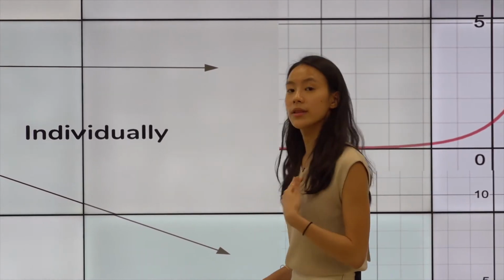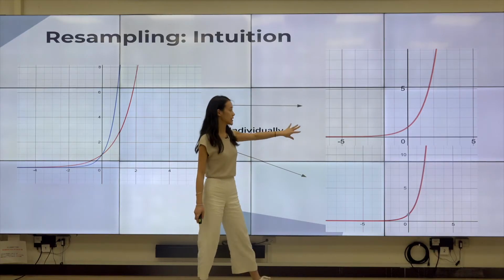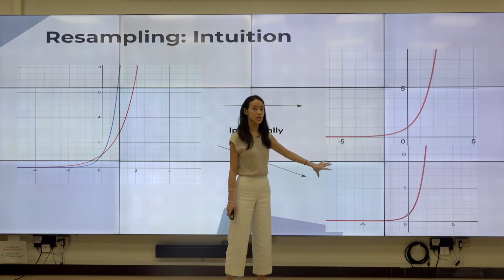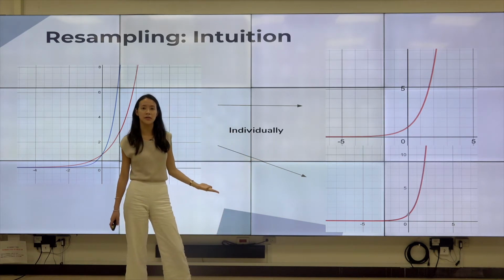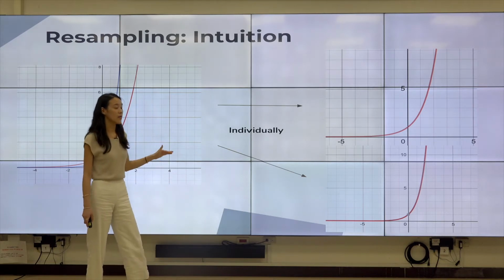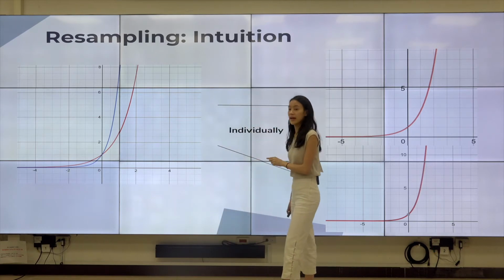The way that I would like to see this is, for example, in two different situations. Let's say that this is the fixed image and this is the moving image. Looking at these two graphs, we can see that in terms of spacing, they're similar. They're very similar in terms of shape, in terms of a lot of things. However, in reality, it's actually very different, as we can see on the left side.